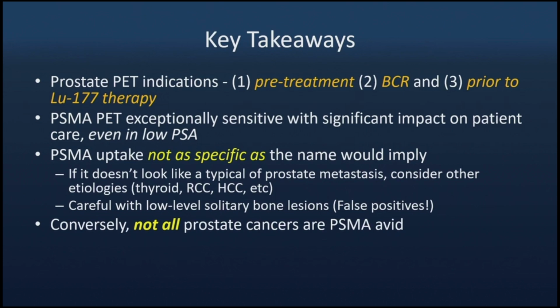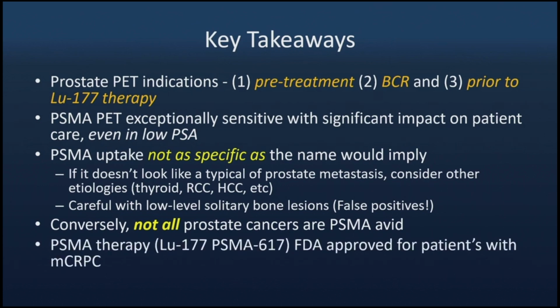Conversely, not all prostate cancers are PSMA positive. Vast majority of them, but not all of them are. And lastly, we can treat what we see. So if they're positive on the PSMA screening, we can treat them with the therapeutic.